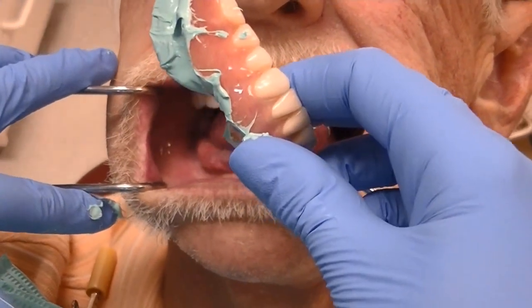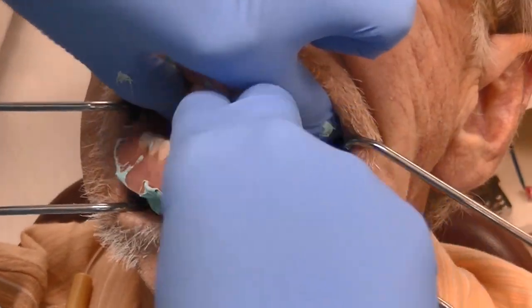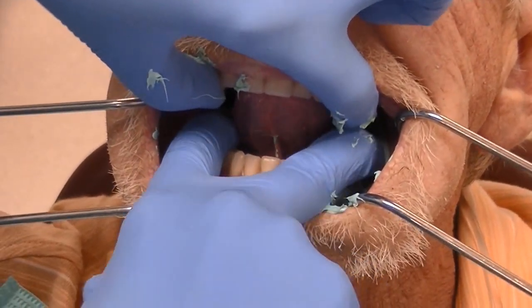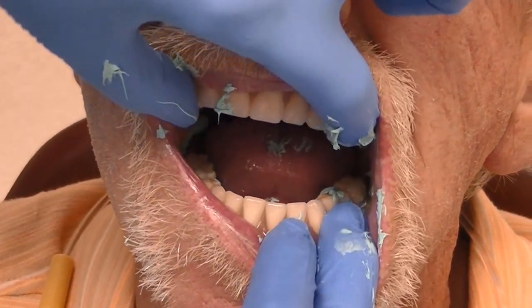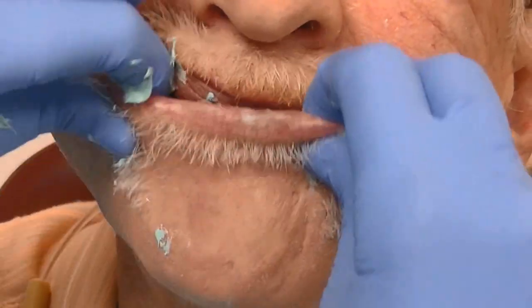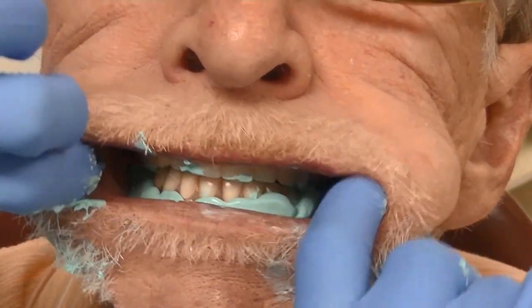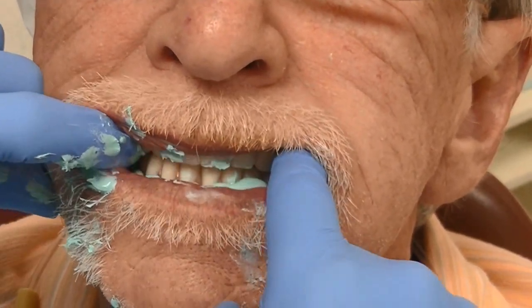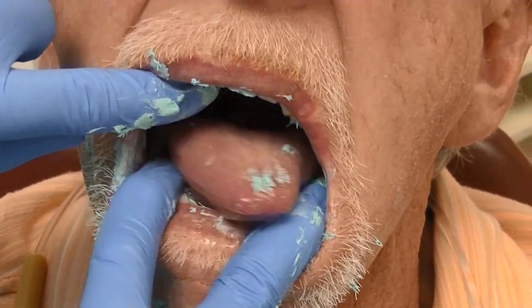We then have the patient pull his cheeks apart a little bit, using cheek retractors to make it easy. We seat the mandibular denture and have the patient very lightly close into a centric position. After ensuring that the denture is seated all the way down, we remove the clips and have the patient do a closed mouth reline technique with border molding procedures as normal. Using the closed mouth impression technique, we verify that the patient is lightly biting into centric occlusion or MICP. It's important not to have the patient bite down too hard, as you don't want a lot of show-through of the reline material.